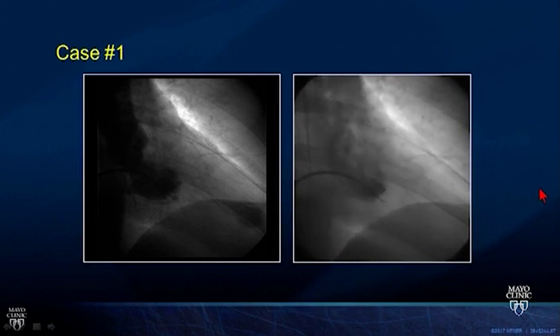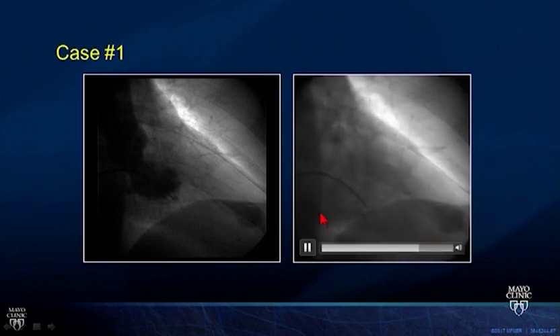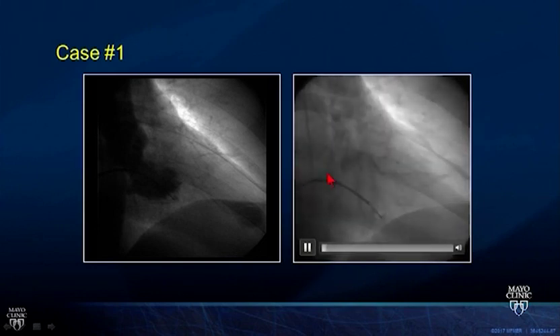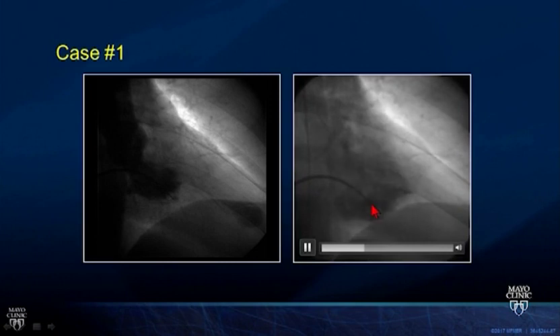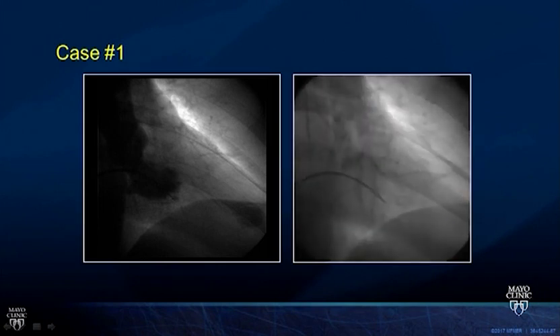And I just wanted to show you this left ventriculogram. This is a patient with apical hypertrophic cardiomyopathy. This is an RAO view. Ribs are going down to the right. And you see this, this is a transseptal Berman catheter going into the LV. And you only see this proximal portion of the LV, the base of the LV, and it's almost completely obliterated here, and then you have an apical pouch, but no obvious thrombus there in the apical pouch.